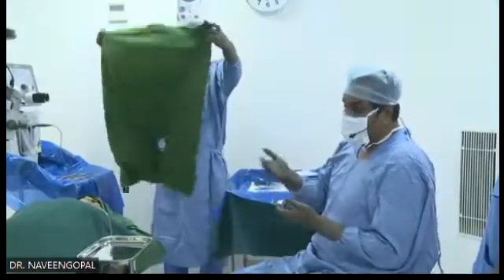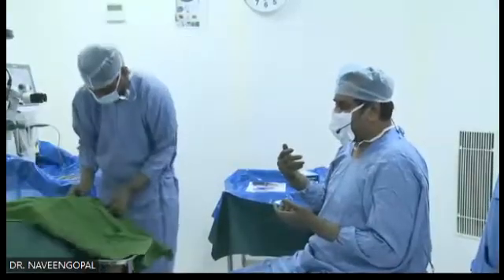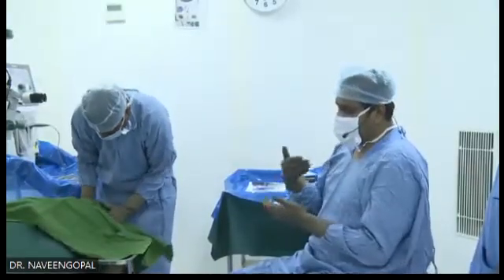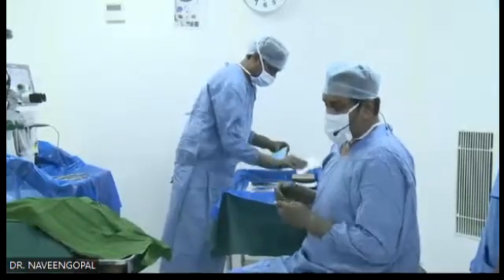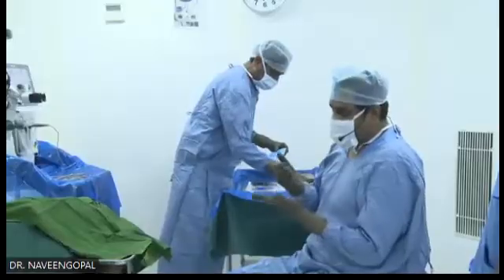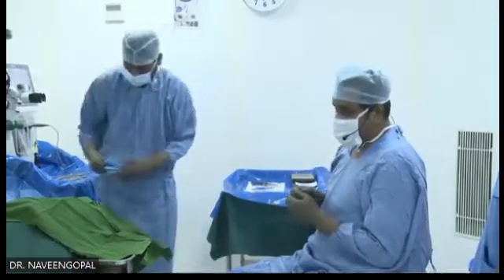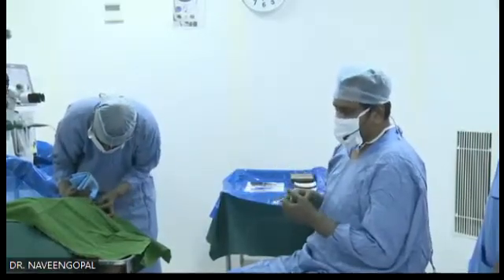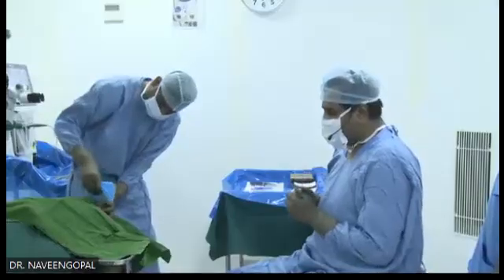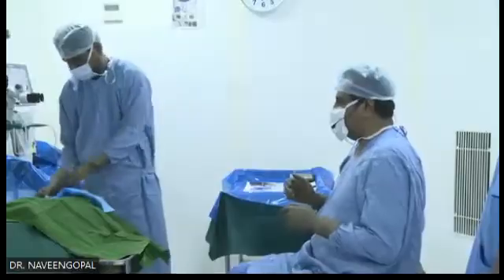So the ELP keeps moving. ELP is effective lens position; if it keeps moving anterior and posterior, I can't predict the post-op refraction. Also I would have centered the ring according to the centration of the pupil, and that centration sometimes goes as the capsule contracts in hydrophilic, which I don't like. So I usually prefer hydrophobic, whichever company it is. This company is good. I'll be demonstrating now.